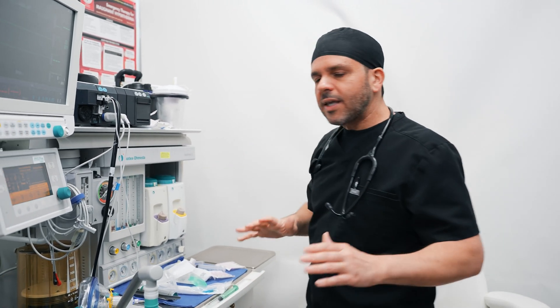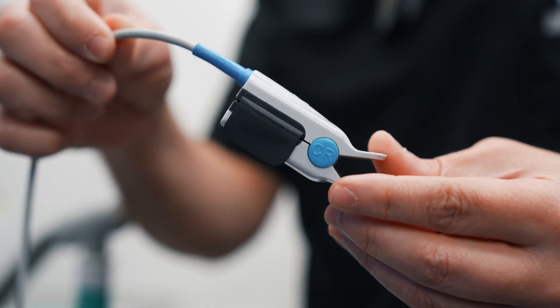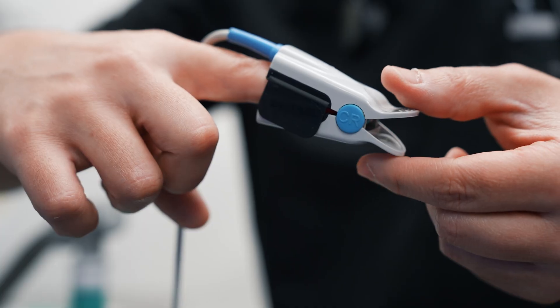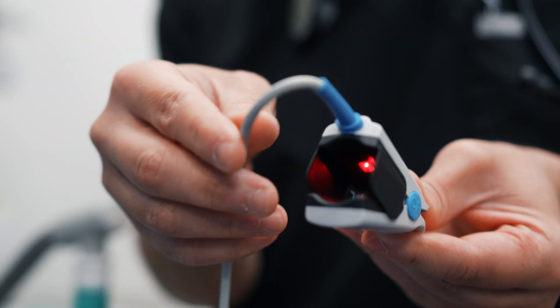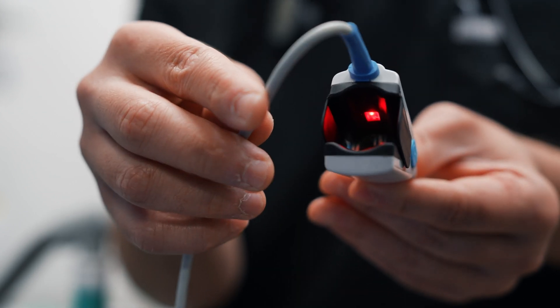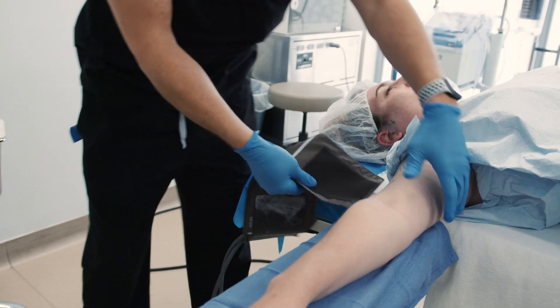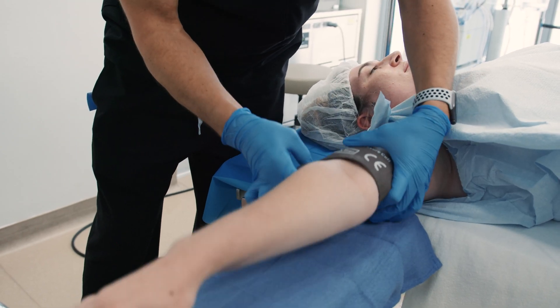Then I start making sure that everything else is prepared — my monitors are ready, including my pulse oximeter monitor. The pulse oximeter gives me readings of your oxygen saturation. Your finger is placed inside the oximeter, which is one reason I ask that your nails not be too long, and certain nail polish may not work, because there's a sensor that has to read the oxygen in the nail bed through the capillary vessels. I also have my blood pressure cuff, which will cycle every five minutes — or every three minutes or whenever I want — to continuously check your blood pressure.